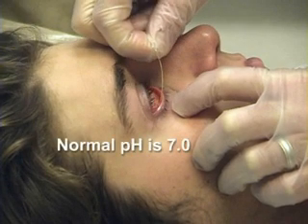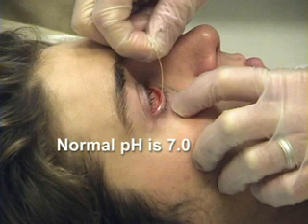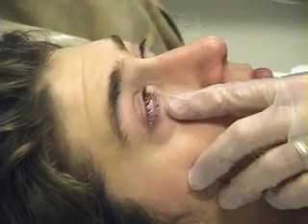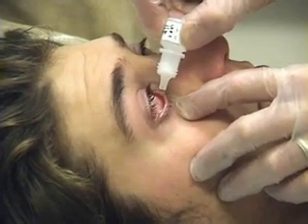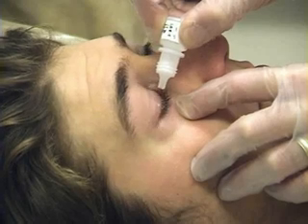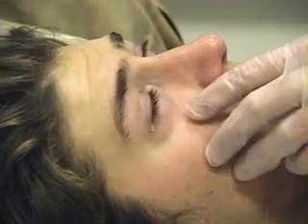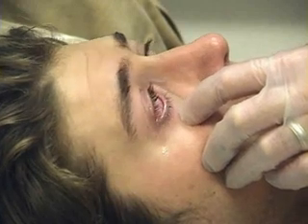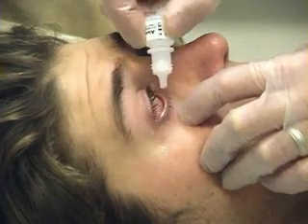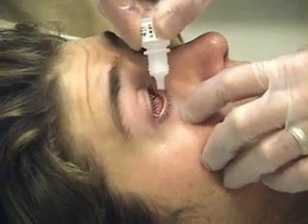Check the pH of the eye prior to irrigation by placing a piece of pH paper in the inferior fornix. Normal pH of the eye is 7.0. Next, place two drops of topical ocular anesthetic in the affected eye. Ask the patient to look upward and place the medication into the inferior fornix.